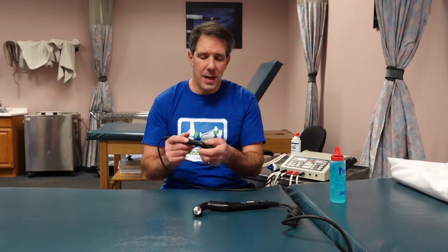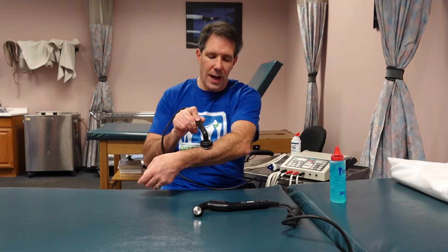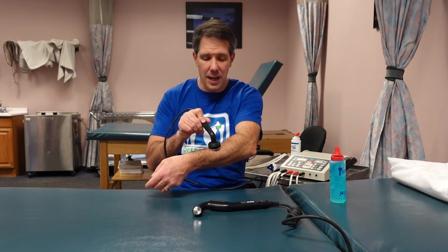Some people have utilized therapeutic ultrasound to identify stress fractures, like a metatarsal stress fracture. When you go slowly over the fracture site, the sound wave causes vibration that can irritate the fracture site. If you pass over an area and the patient has a significant deep ache right at that spot, then it's less painful as you move on, and painful again when you return, you may want to suggest they get an x-ray. It's not a super dependable diagnostic method, but it can be a useful screening tool.